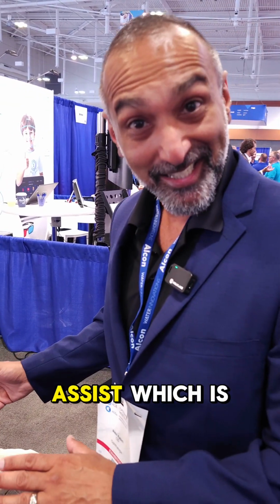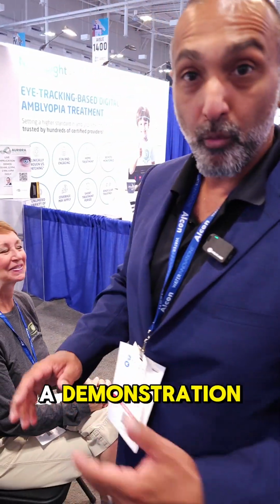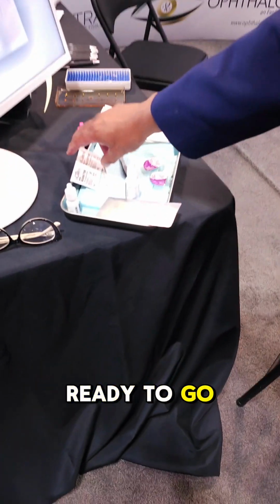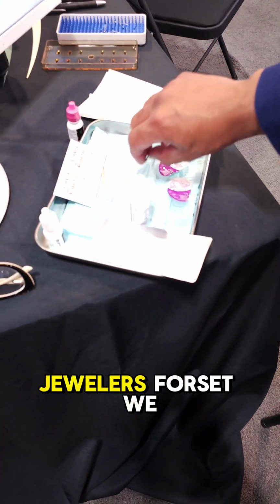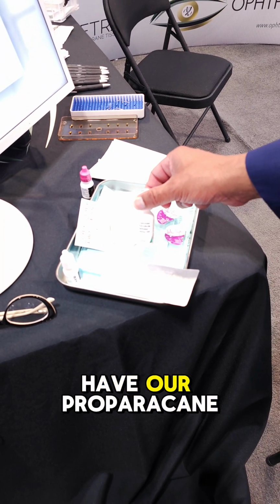So we have a patient ready to go here. She's also going to assist, which is not really the norm, but we're doing it as a demonstration. One thing that'll save you some time and get the timing of the whole procedure right is having your stuff out and ready to go. So what we have out and ready to go, we have alcohol pads, we have our jeweler's forceps, we have a bandage lens, we have our membrane, and we have our proparacaine.